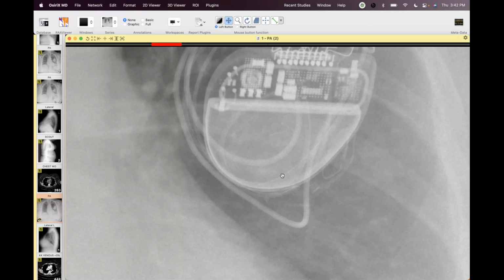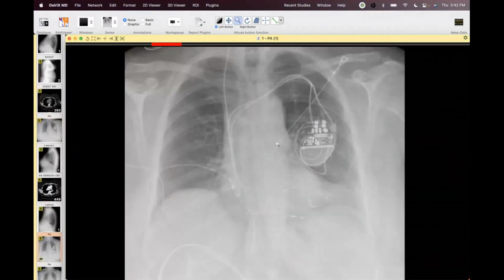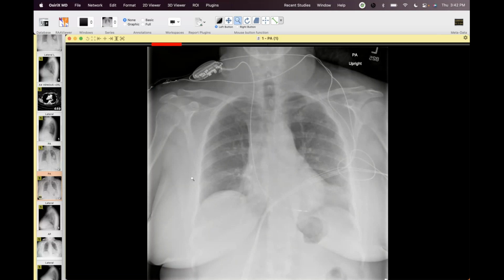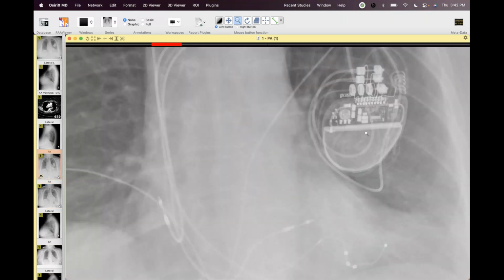Doesn't it disturb you, Travis? The marker, and it looks a lot like a Raytex sponge. You think they would make it more distinct. Well, we've had a lot of discussion about these, and probably it's the same in your operating room. Most of the sponges that they use now have RFID, so they wave a wand over the patient afterwards and can quickly figure out if there's any signal that something was left behind. But these are pretty sneaky.